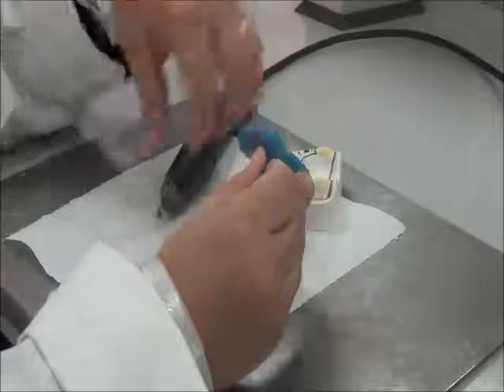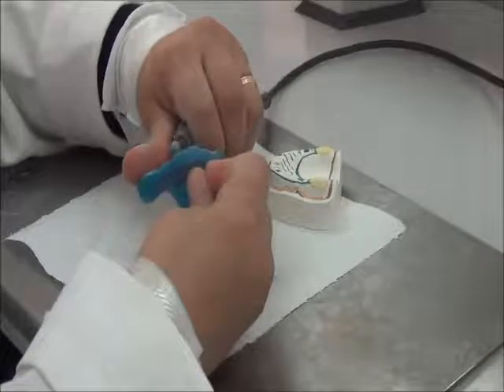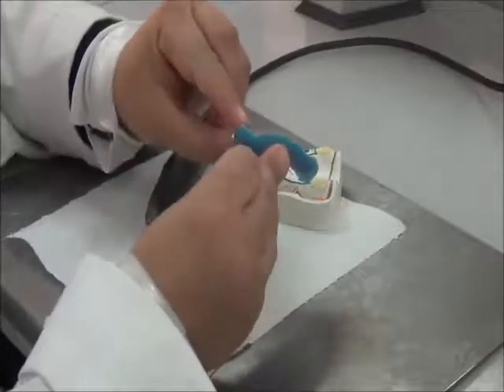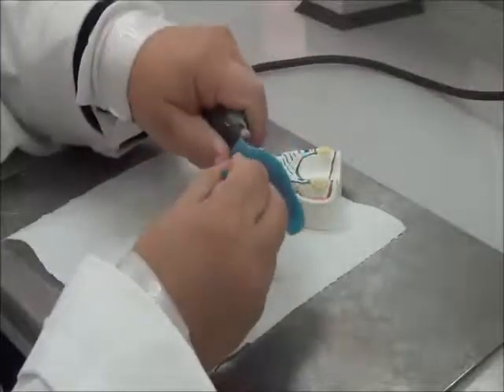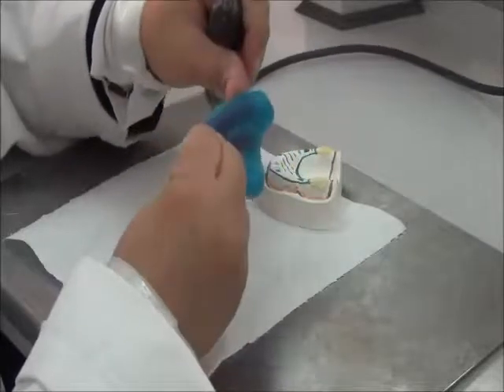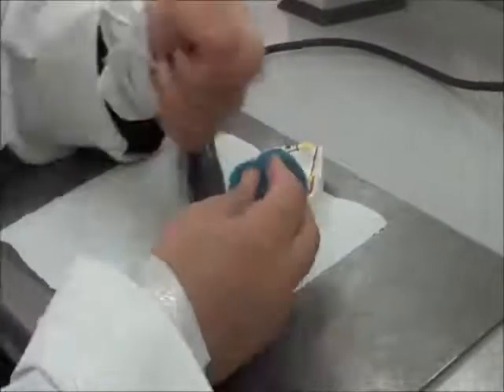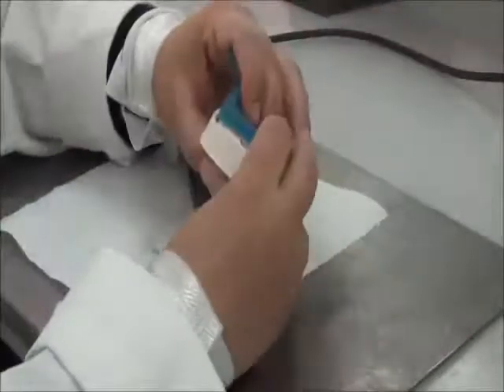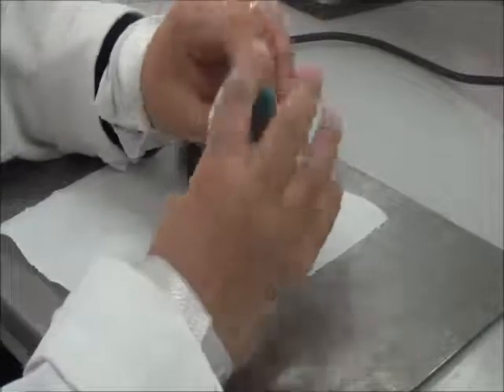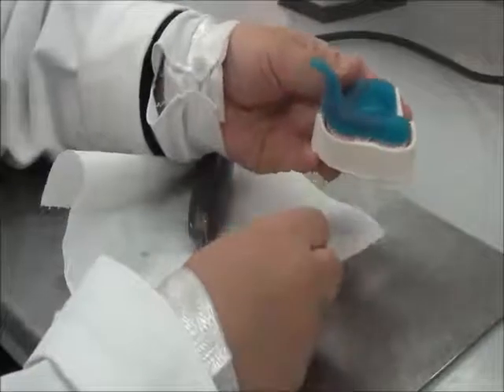Once I'm finished, if I run all around, I should have no sharp edges. There's a sharp edge here that is detected by my finger. So I should have no sharp edges. There's a raised bit here, a bit rough, but not sharp. This is where you need your old toothbrush, where you can brush away the particles. And then I adapt it back to my cast and make sure that all of the borders are following the orange line here.